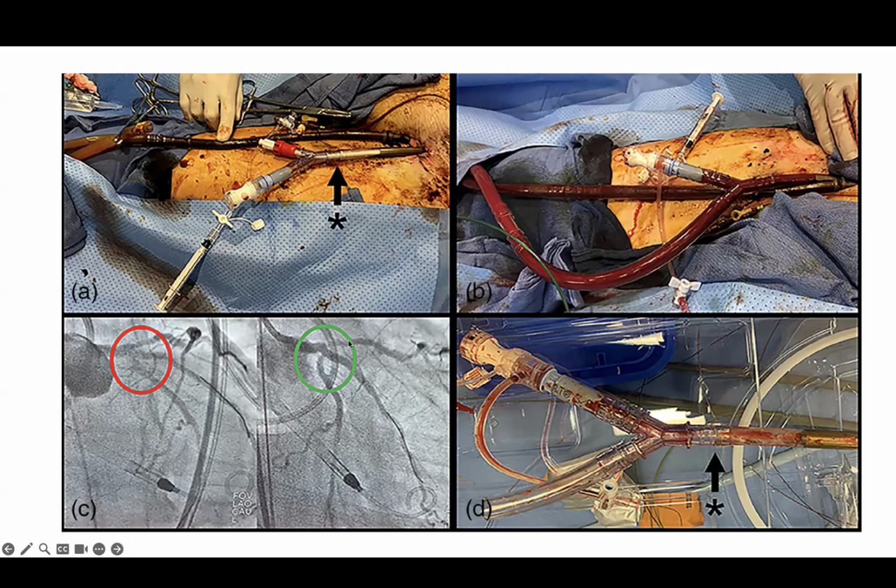That's so cool. Yeah, and the only issue I remember is that we didn't account for all this dead space. And I say we, because I wasn't doing anything, I was just holding the groin, but my attending, we didn't account for this, and so the guide wouldn't reach. So we used a JL5 guide, you can see it here, barely reaching, airmailed the wire, and then guide-lined the whole thing. Holy smokes.